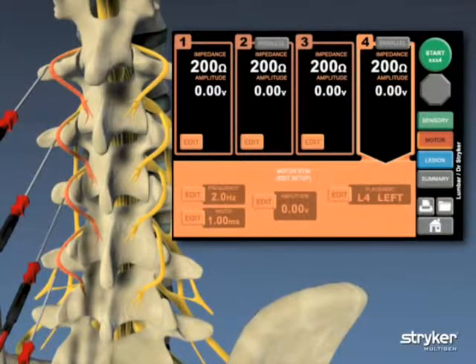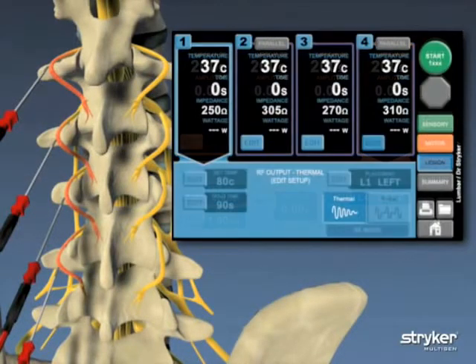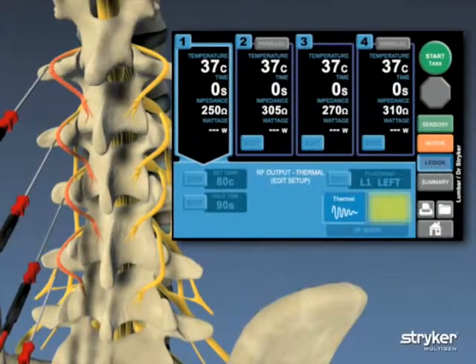After the sensory and motor diagnostic tests have been confirmed, the user moves to the lesion screen and selects either thermal or pulsed radio frequency, or a combination of the two. For this demonstration, thermal radio frequency is performed with simultaneous starts in all four locations.